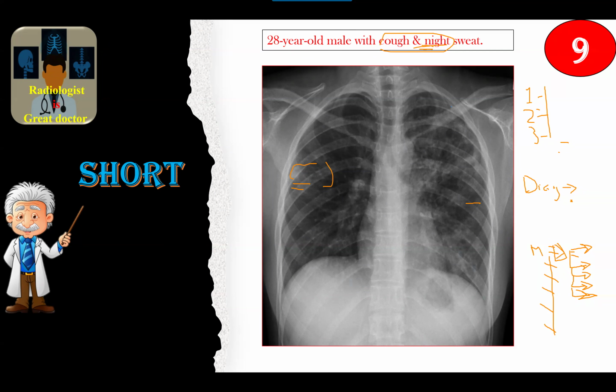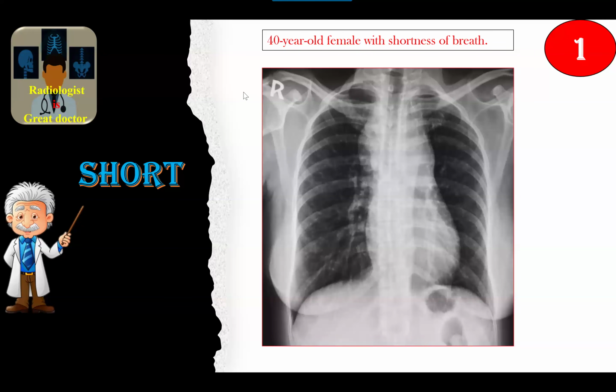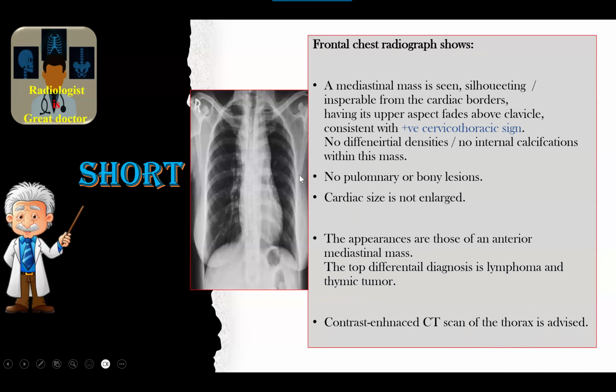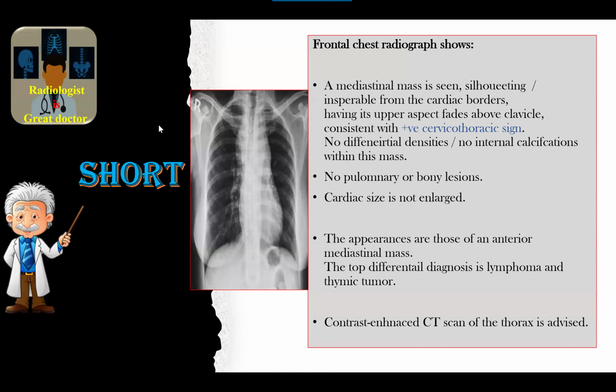Okay, thank you. So in summary, my friends, for a short reporting case, it's the same way you deal with the oral, but in short sentences, in short paragraphs. The same way of study. We have, alhamdulillah, plenty of time. It's okay to give two differentials, like this case. In my usual daily report, I put 2 or maximum 3 according to time.